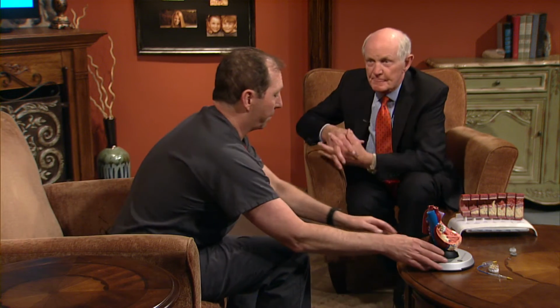When the big heart pumps, it throws the blood out the aortic valve. If it gets sticky or if it gets leaky, you can fix them. So show me what you do. So this is a model where the aortic valve was narrowed, and with a balloon catheter technique, we go in and place a stent valve, and again, deflate the balloon, take that away, and the stented valve remains open, and that releases that narrowed or stenotic valve.